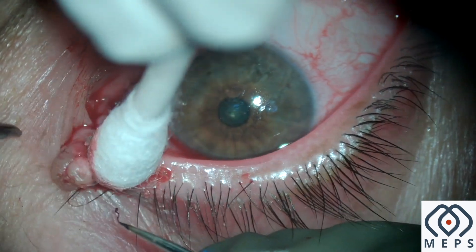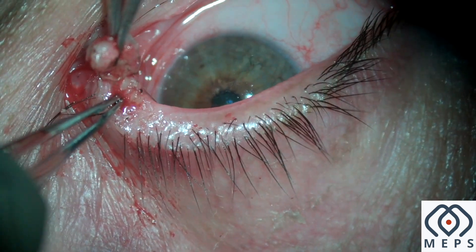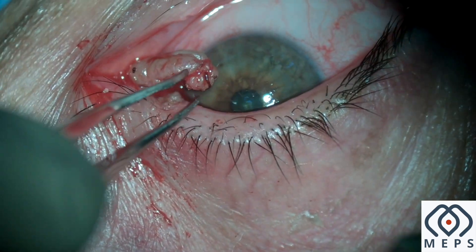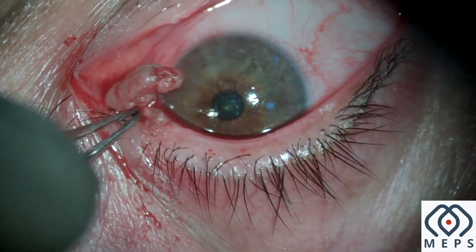Alternatively, you can use a 15 number blade to shave this off from the tarsus. Care has to be taken that the power should be at the lowest possible setting to prevent coagulation of the tarsal tissue.